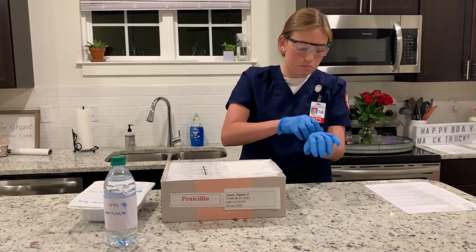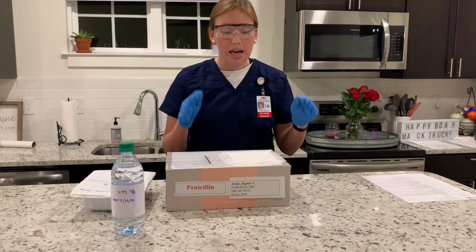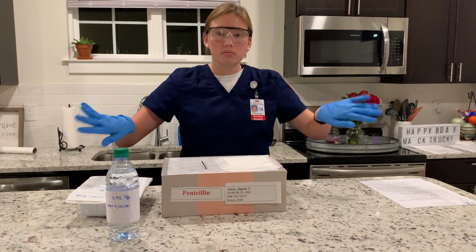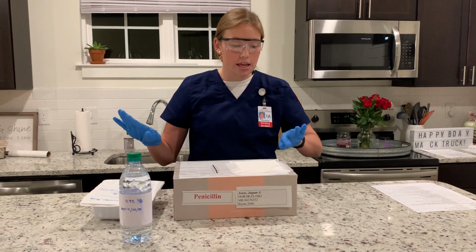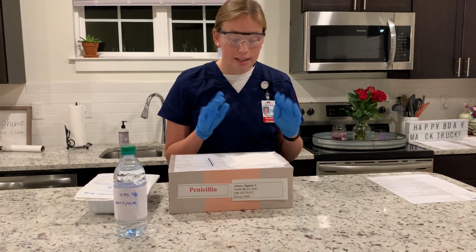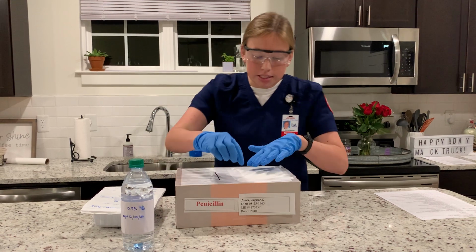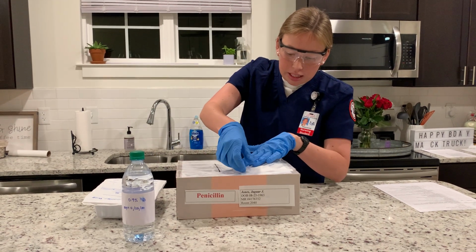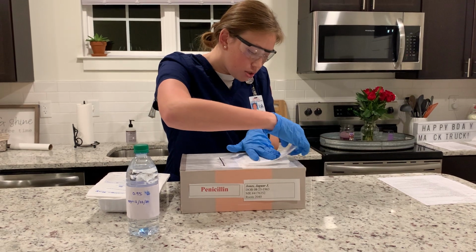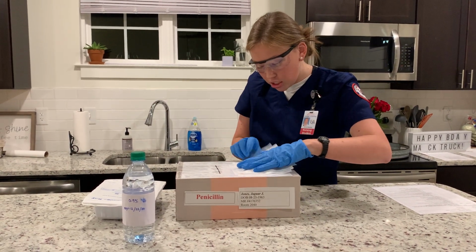Okay, now they're all situated. Now I'm going to expose the patient by pushing back any dressing or covers. I am then going to take off the ABD pad and expose the open wound and the suture line. I'm going to take off the ABD pad by peeling the tape towards the wound, being very gentle and not tearing the wound or causing any pain to the patient.